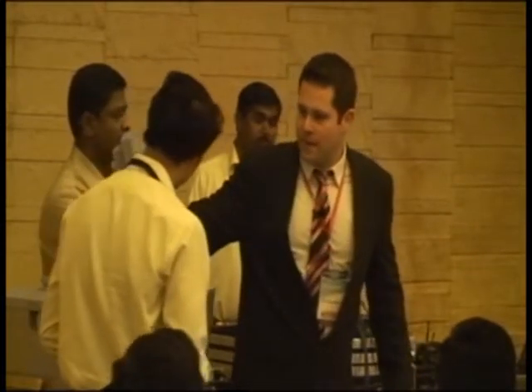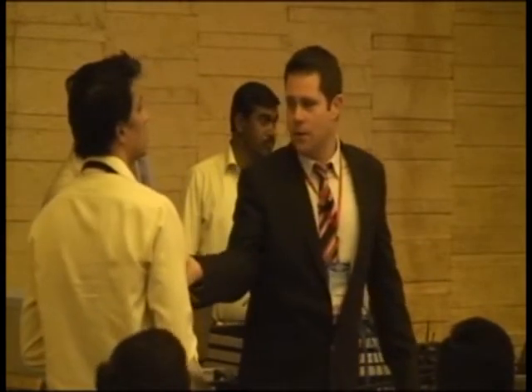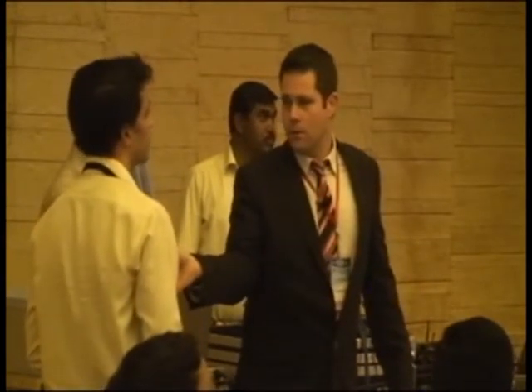Okay, so we're going to come along. Let's turn our volume back up again then. Okay, we're about 482. Let's do an expiratory hold. Okay, there you go. We did an expiratory hold. Now we're going to freeze the screen and let's scroll over here. This is your auto PEEP. It's 25. Your auto PEEP in the lung is 25 centimeters of water pressure.